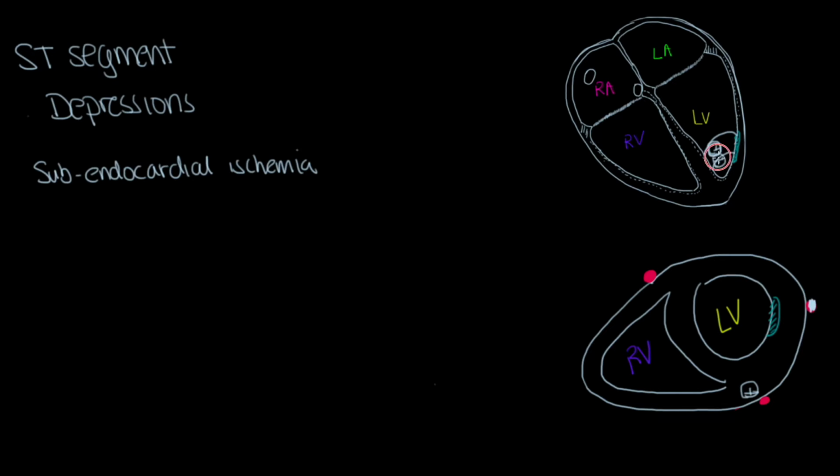What we usually see is the charge moving outwards this way, or moving out toward us, out of the screen. What's important to understand is that the ECG says that the overall charge up here, for example, is moving out that way. But what's happening in reality is that the charges go out concentrically like this.